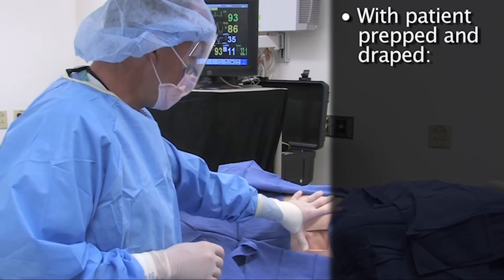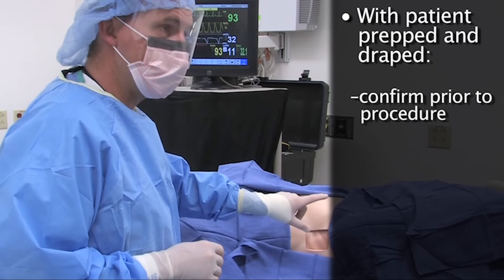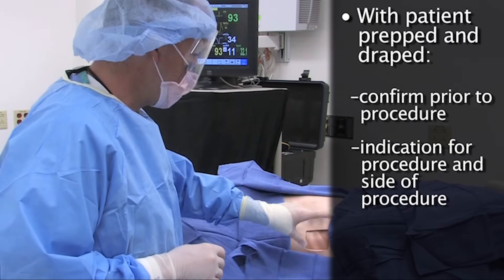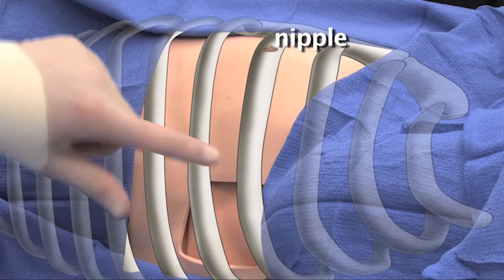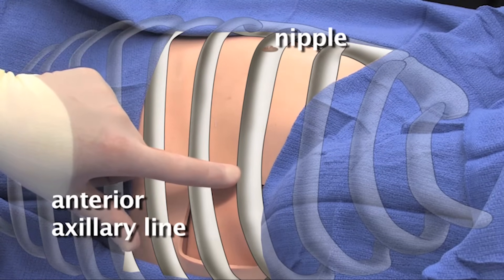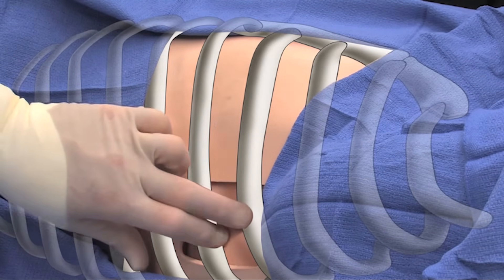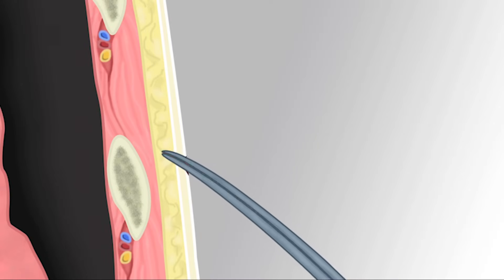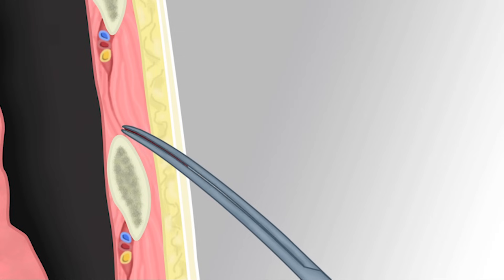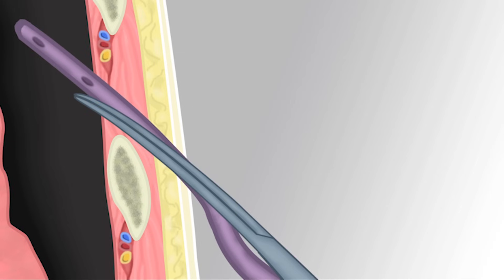With the patient prepped and draped, we confirm one last time the reason for the procedure and confirm the side — in this case, the left chest. We confirm anatomical landmarks: the nipple and anterior axillary line, representing either the fourth or fifth interspace. We palpate the ribs, make the incision, tunnel above that incision just above the rib, then bluntly dissect into the pleural space, holding position with the clamp, through which the tube will then be placed.